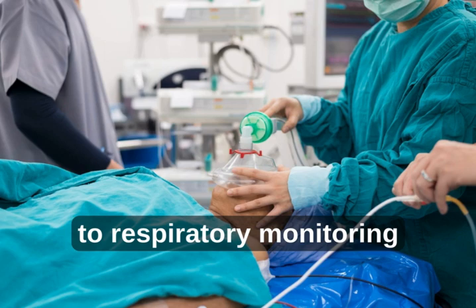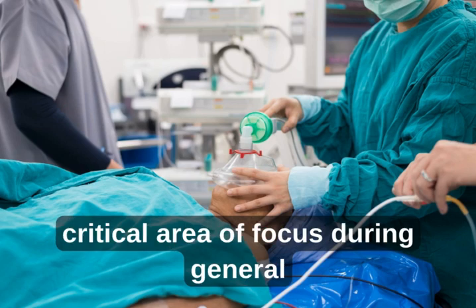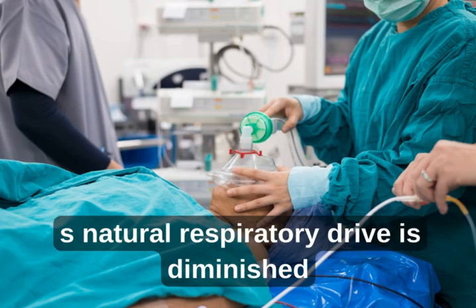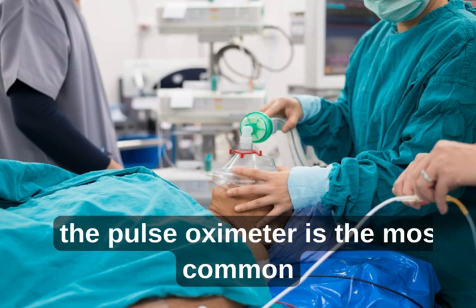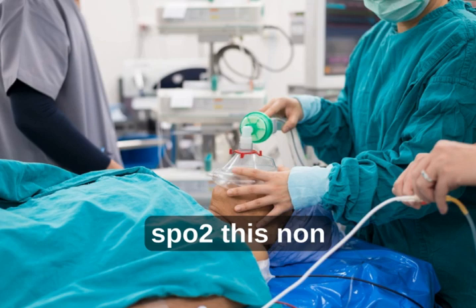2. Respiratory monitoring. The respiratory system is another critical area of focus. During general anesthesia, the body's natural respiratory drive is diminished, so we must actively manage and monitor ventilation and oxygenation. The pulse oximeter is the most common tool for assessing oxygen saturation, SpO2.